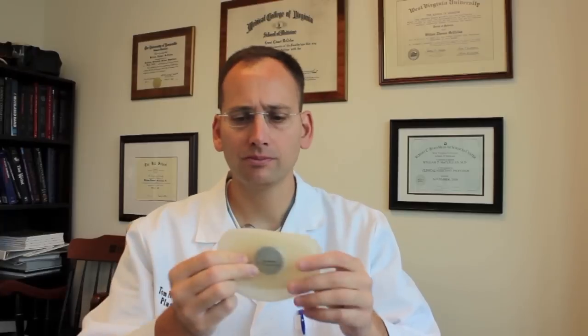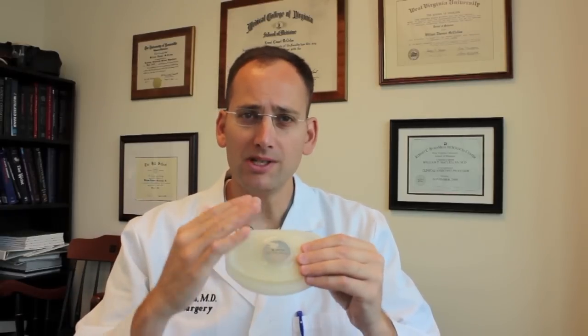In the operating room, this is placed under the pectoralis muscle and you can fill it with variable amounts of saline depending on how large you want to make the breast, at least initially. The skin is sealed over it and sutured up, but how do we access this tissue expander once it's under your skin?